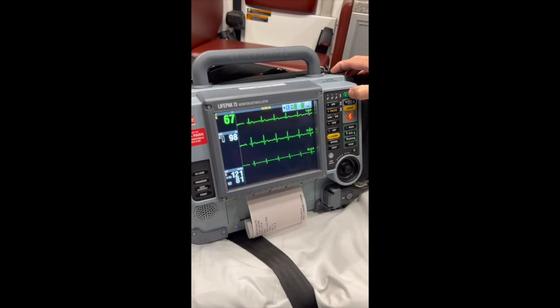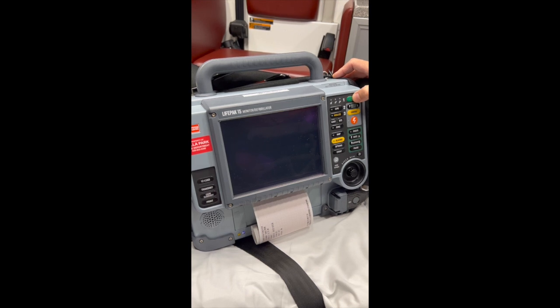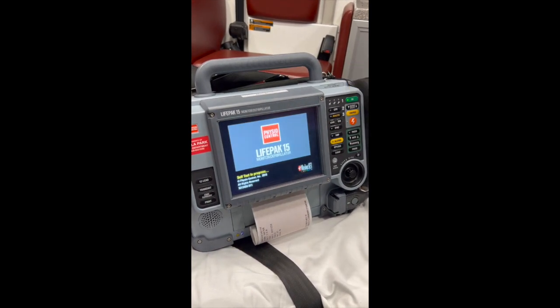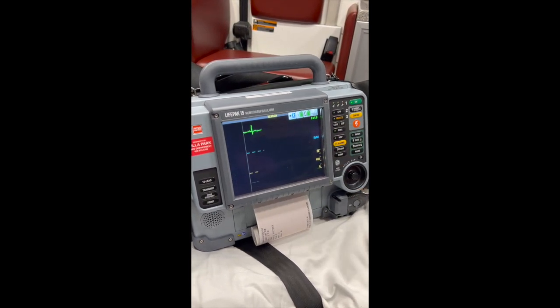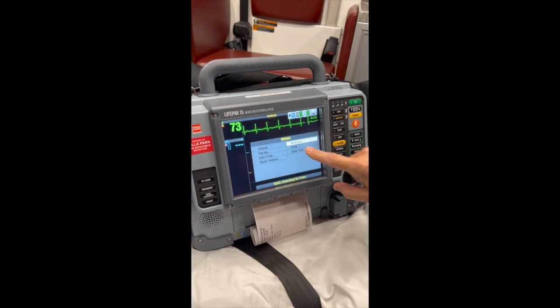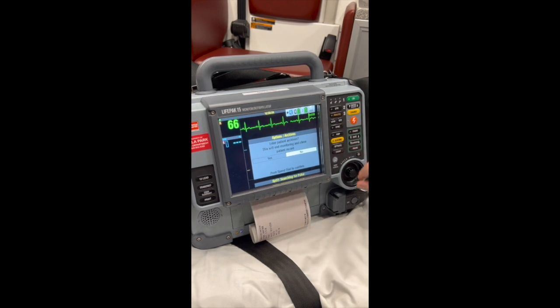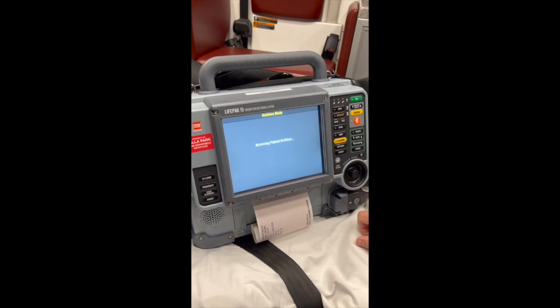If the monitor has been shut off and we turn it back on, if it's been shut off at the hospital and you still need to send something, when we power the monitor on, it's going to come to a new event. In order to pick a different one, we're going to have to press the options button and go to archives. Once we go to archives, it's going to ask us if we really want to do that because we're exiting a current patient. Select yes, and it's going to switch over to archives.